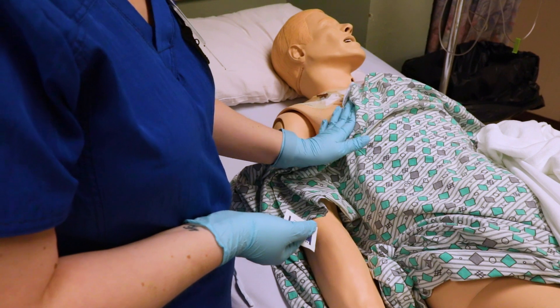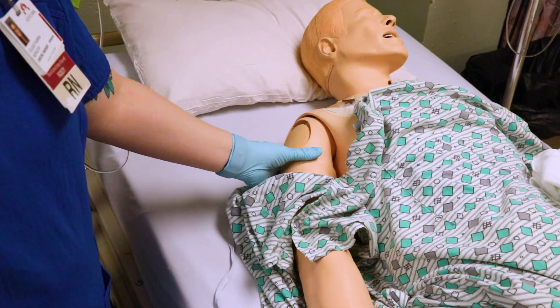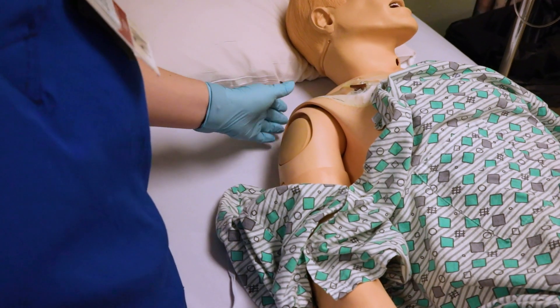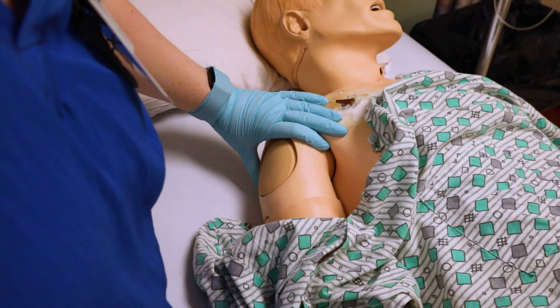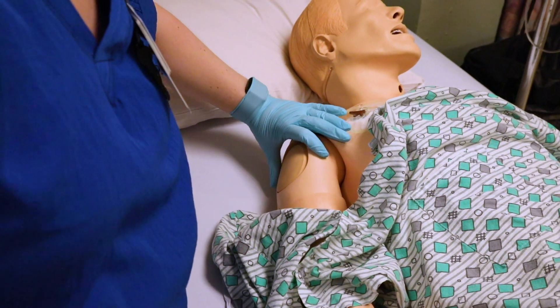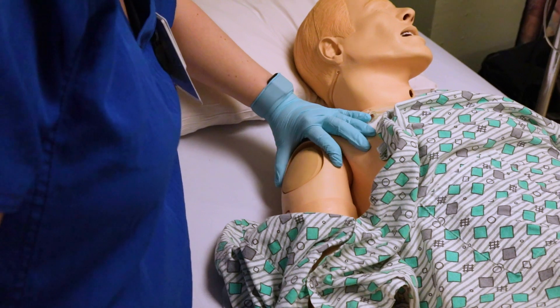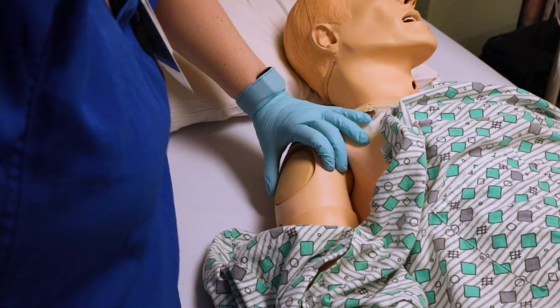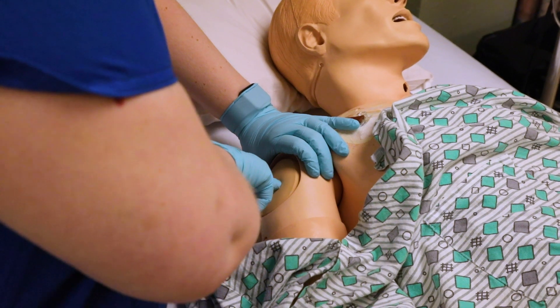When doing the deltoid, you want to expose the patient's arm and you always have to find your landmarks. The landmark at the top is called the acromion process — that's where the shoulder bone is, that ball and socket. If you find that, you can pinch the skin like this, and you see my hand makes a little C shape at the top. You want to give the injection right in the middle of that C shape.